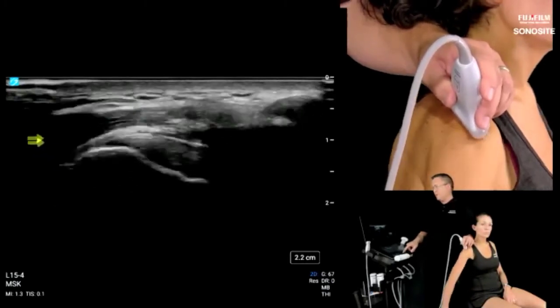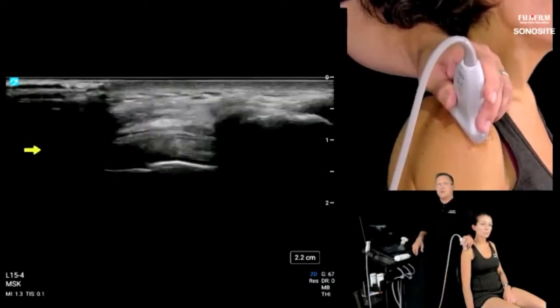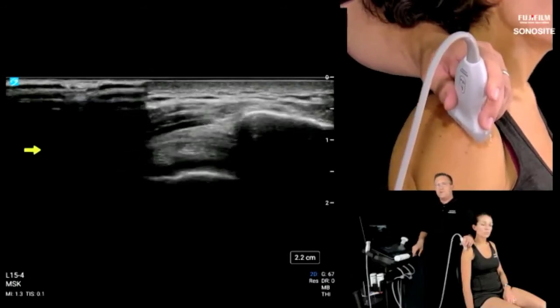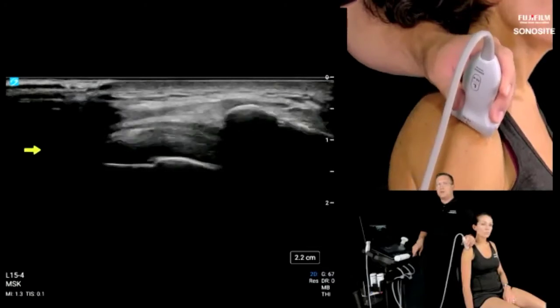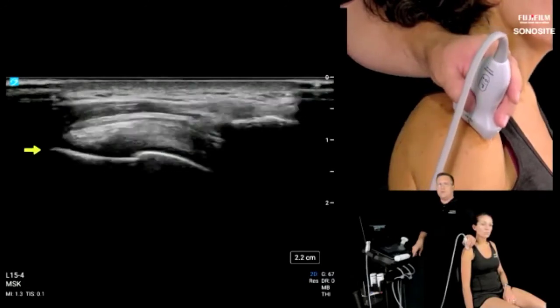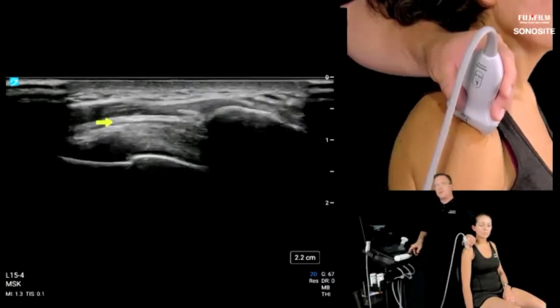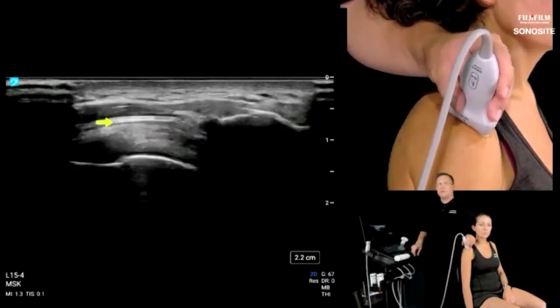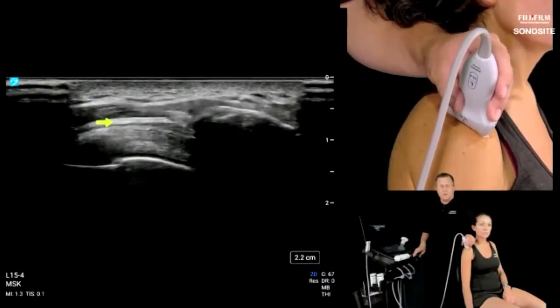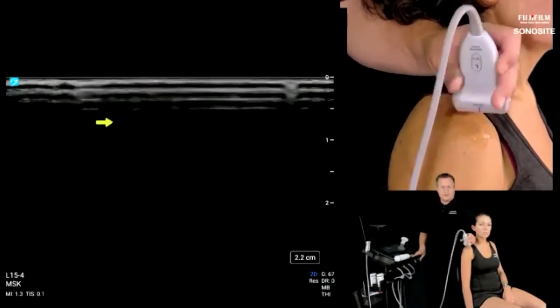Don't worry about this air gap out to the side. That actually shows me, if I'm the one looking at your pictures, that you're not applying too much pressure, that you do not have the weight of the probe over the deltoid. So while it's not a real pretty picture to leave the air gap out there, it's fairly useful, for somebody that's helping you read your images, that you're not collapsing the bursa with the weight of your transducer. But ultrasound is absolutely used for impingement of the shoulder of all kinds: subacromial impingement or subcoracoid impingement, the subacromial bursa impingement, and other adhesion pathologies in the shoulder.